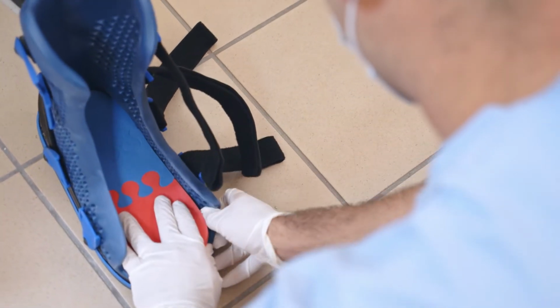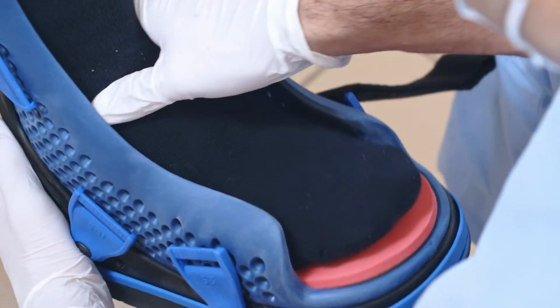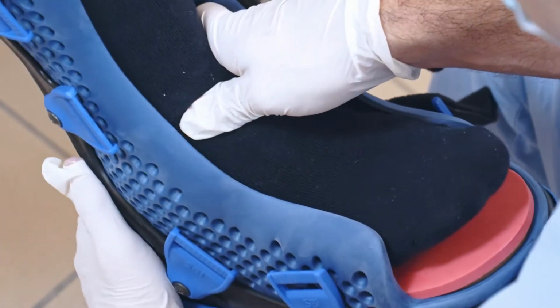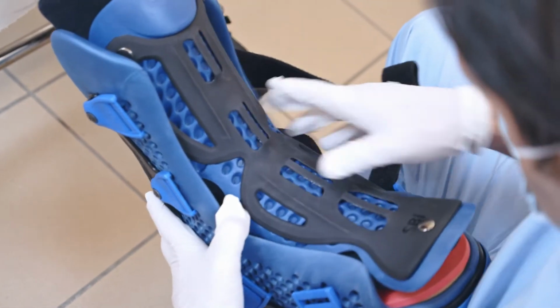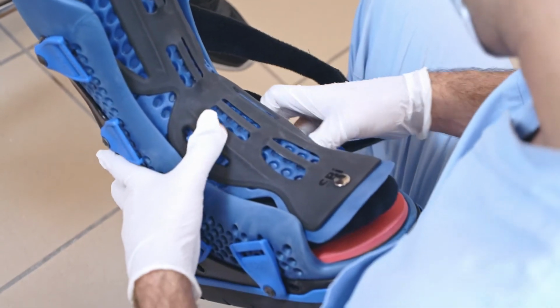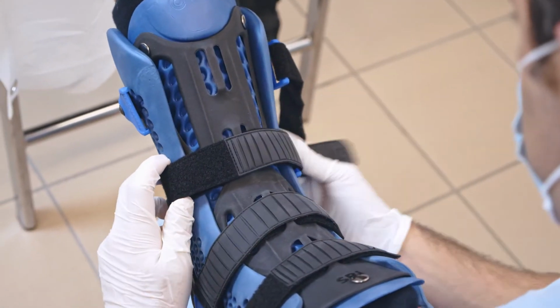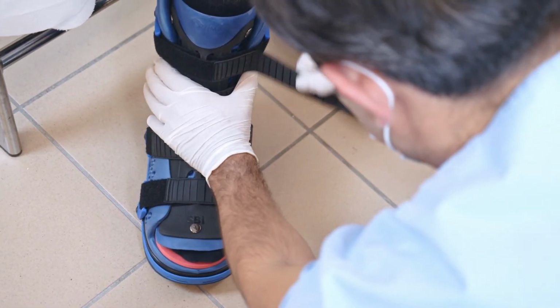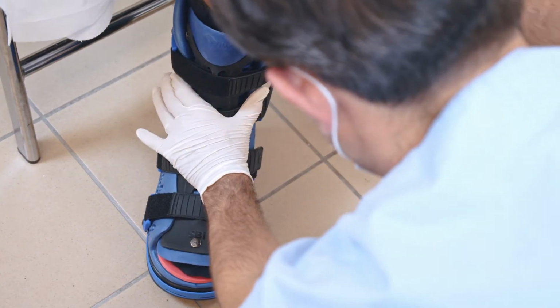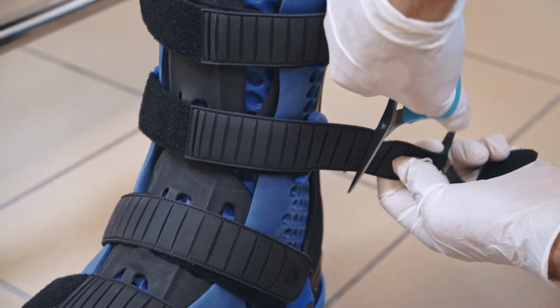After finishing the dressing, we insert the kit 3x3 into the Walker device and place the patient's foot inside it, making sure that the entire surface of the foot is well positioned within the EVA lining. We apply the 2-component tibial protection, which comes with slots for the velcro straps. This detail guarantees the full distribution of the patient's weight over the entire surface of the leg. Once in place, it is important to reattach the velcro straps. The excess can be cut to avoid a trip hazard when walking.